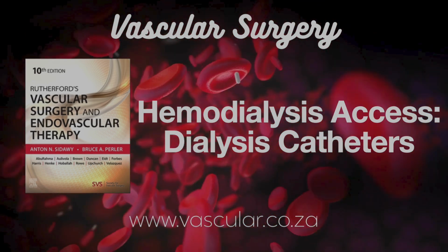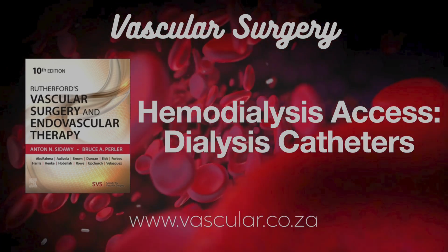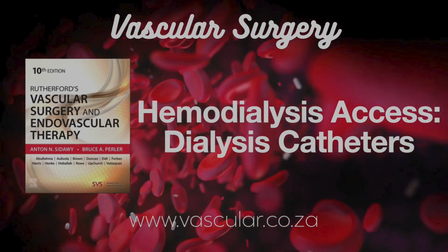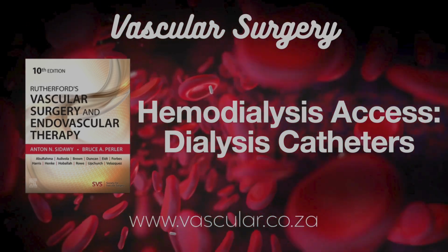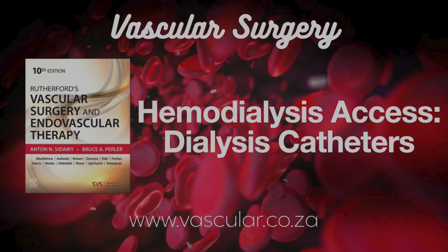You know, that's the interesting part. Lots of studies have looked at this, comparing flow rates, recirculation percentages, how long they stay open and working, which we call patency, and no single design has consistently come out on top across the board. One might be slightly better for flow in one study, another might show less recirculation in a different setup, but then maybe not have great patency. Huh.